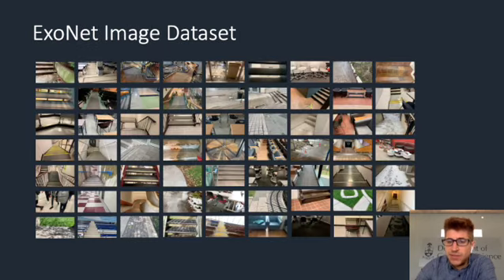And so this motivated us to develop the open source large-scale ExoNet dataset. Again, we used a wearable RGB camera to collect images of indoor and outdoor real-world walking environments. However, this time we collected over 52 hours of video, which amounted to approximately 5.6 million images. And we uniquely collected these images across multiple seasons in order to take into account different weathered surfaces like snow, grass, and multicolored leaves.